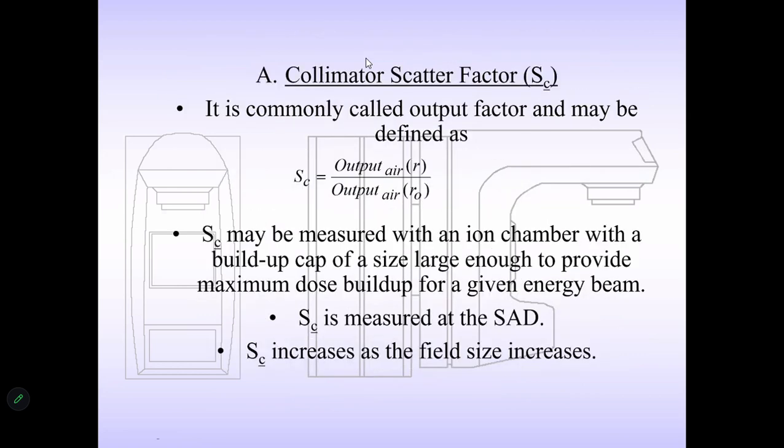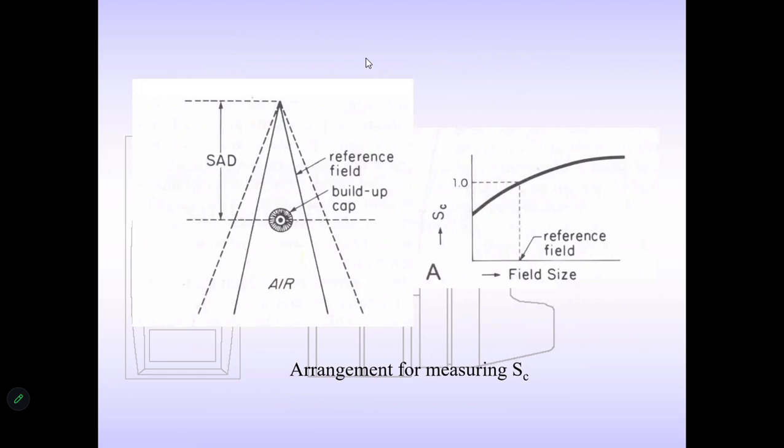Dose calculation algorithm, you don't really need this. This is for calculating the collimator scatter factor, which we said we measure in air.